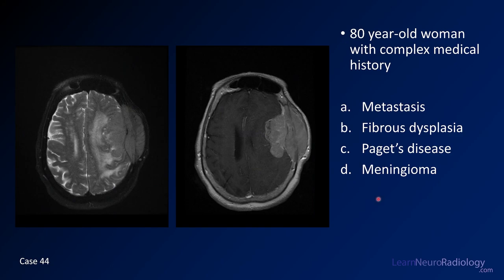Case number 44 is an 80-year-old woman with a complex medical history including hypertension. These are images from her brain MRI — a T2 and a post-contrast. Your choices are metastatic disease, fibrous dysplasia, Paget's disease, or meningioma.